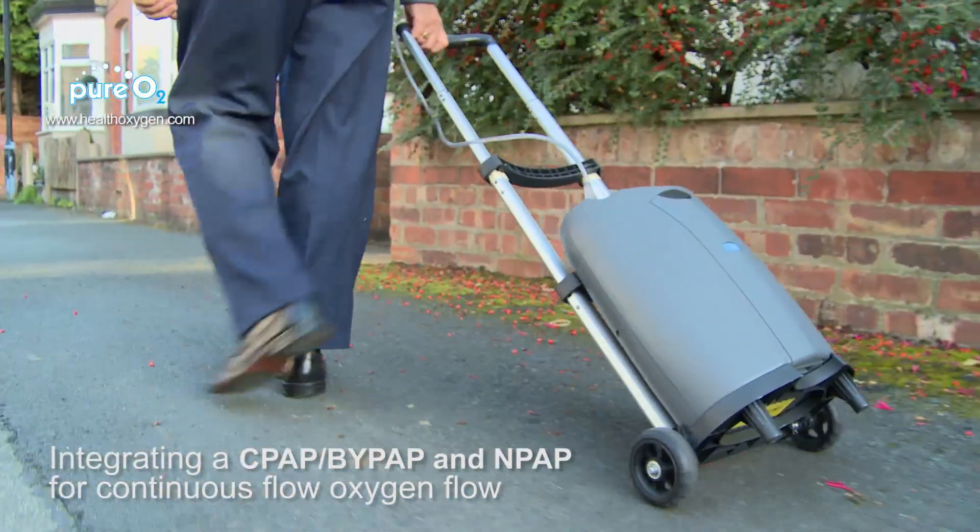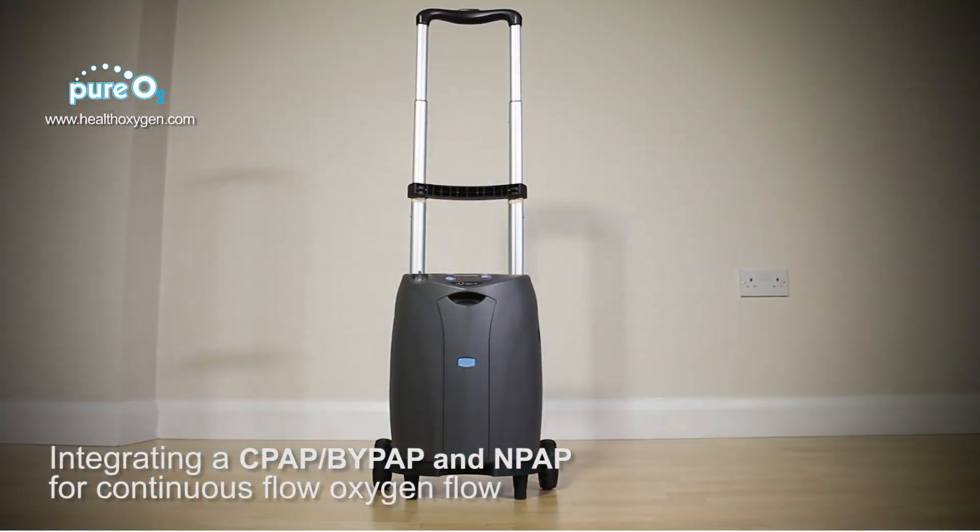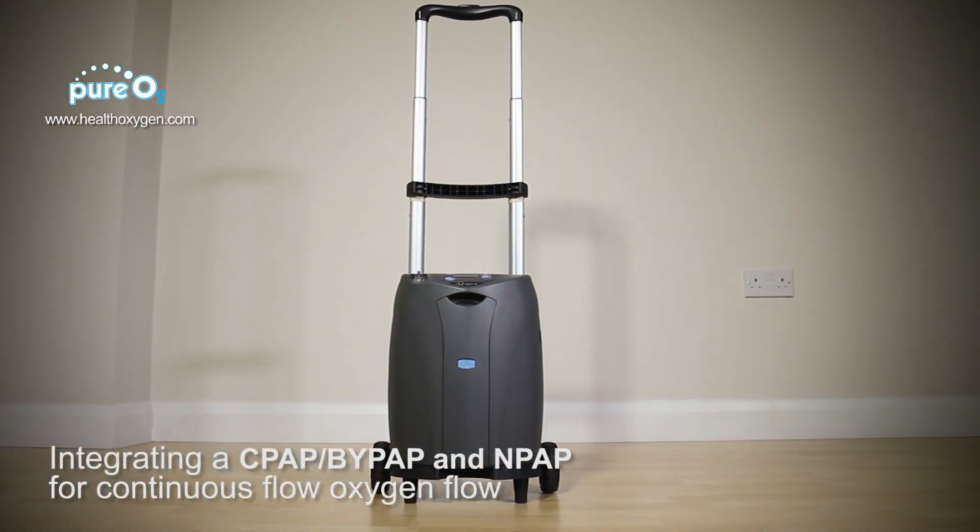Most importantly, this device is approved by all major airlines. Pure O2 offer an excellent, helpful advice service to make sure that you're considering the correct machine for your medical needs.